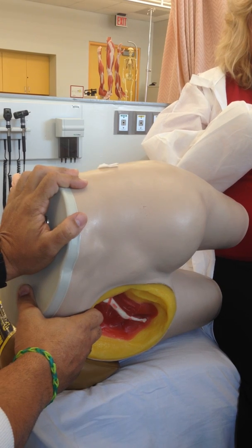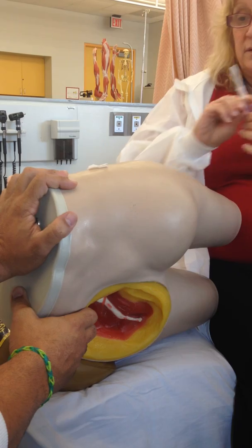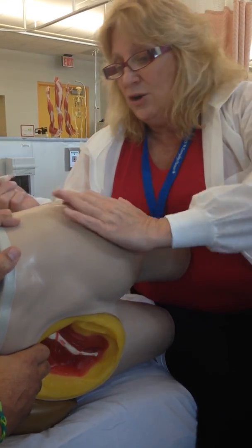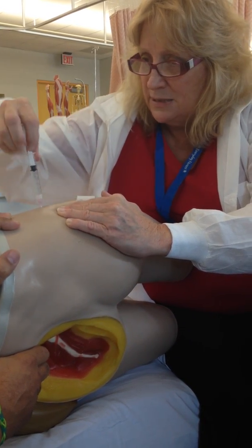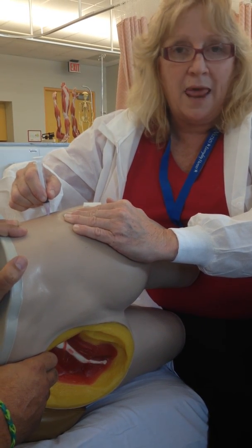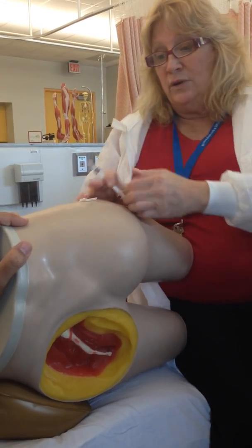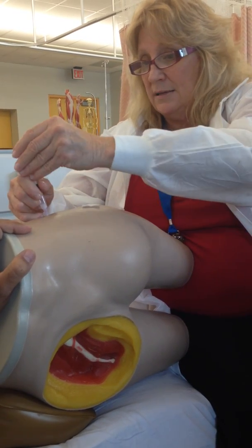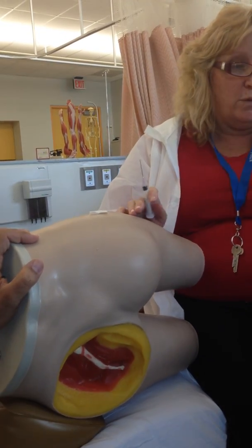You have your fresh needle, your 2 mils, and your air lock. You're ready to go. You pull this aside. You have your gloves on, and you're going to pull the skin, inject one-handed, come up like this, aspirate, inject, slide down, count to 10, 1, 2, 3, 4, 5, 10, then pull out and release at the same time, and it seals over. The ventral gluteal site, I can also give it without Z-Track. Aspirate, inject, two-handed technique as opposed to the one-handed technique from before.